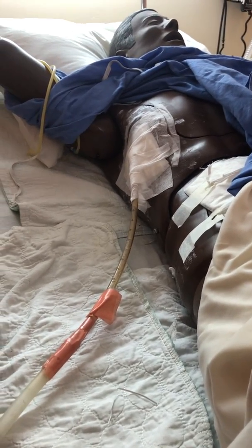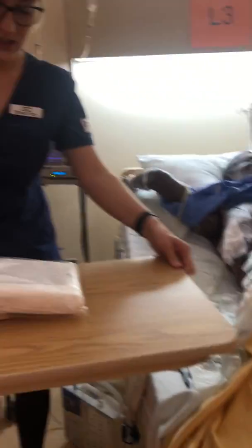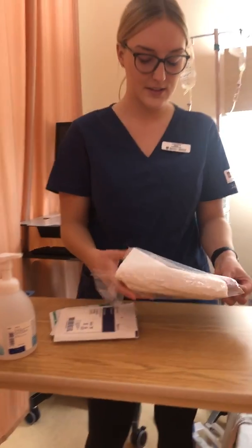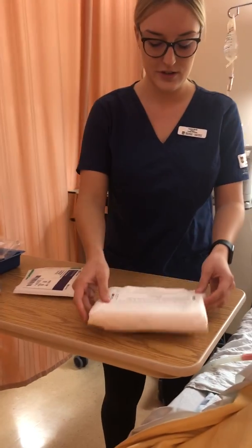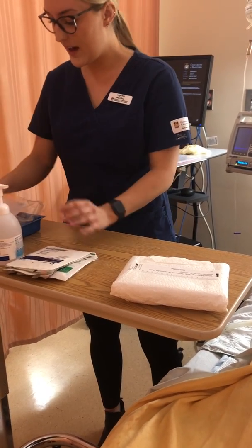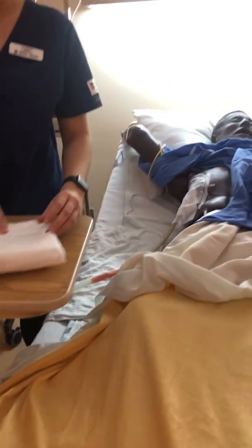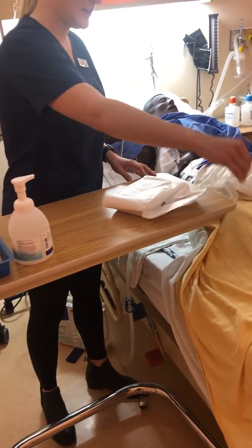So Bryson, I'm just going to get my supplies ready now to start your dressing change. I've done hand hygiene again, and I have my dressing tray here. Before, make sure I have everything that I need. Okay, so I'm going to begin to open my tray here.